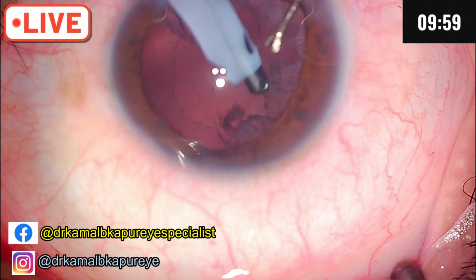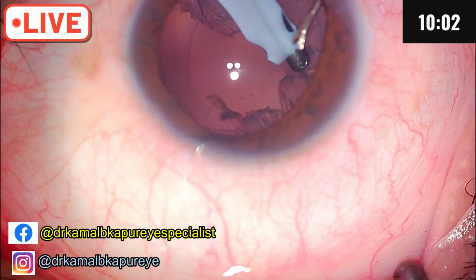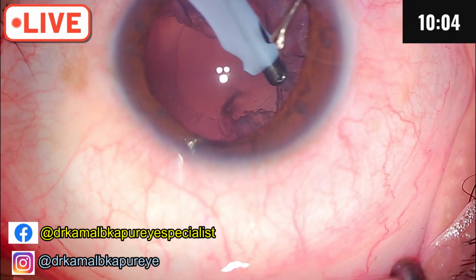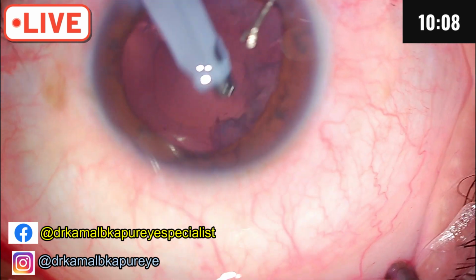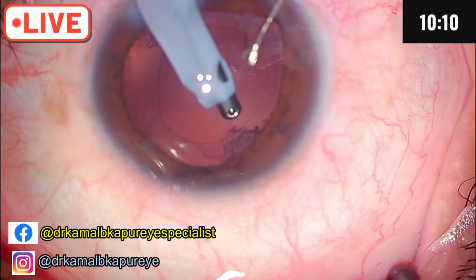Radial movement to loosen the cortex. There, slow peeling movements.